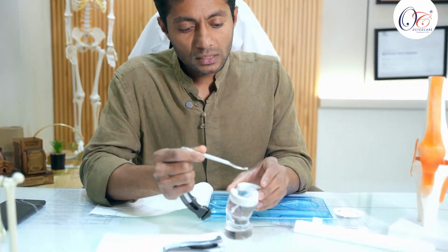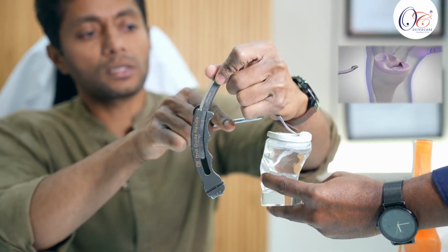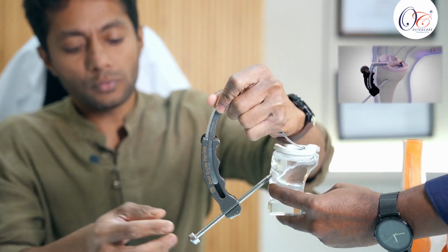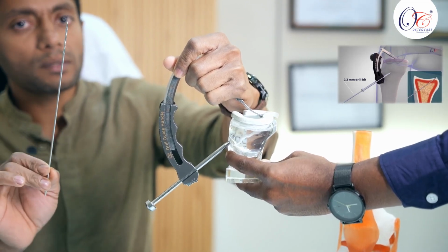So initially when we drill the tunnel, here the tunnel is already drilled, but this jig is used to place the tunnel where we want it, so this is how we drill the tunnel using the jig. We place the jig where we want the tunnel to be prepared, and then we put this bullet and we drill it with the 2.3 mm drill bit. All we have to do in this procedure is drill the tunnel with a 2.3 mm drill bit.